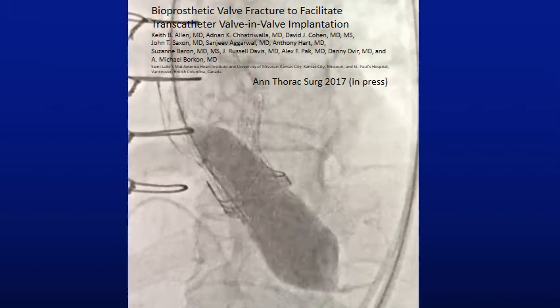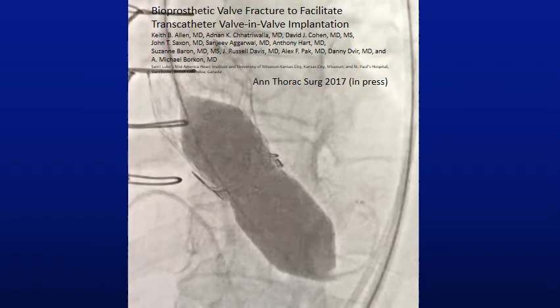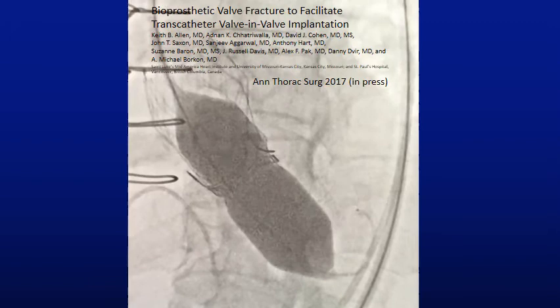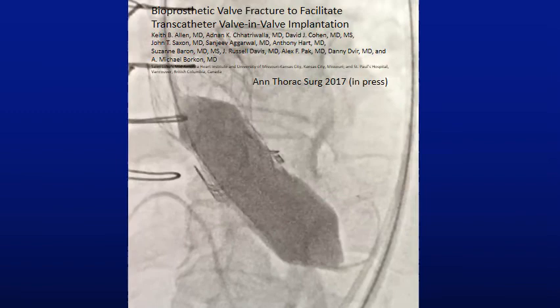If this were a breakable surgical valve, we would fracture the valve using a non-compliant balloon with high-pressure inflation. Observe the waist of the balloon release and the frame pop, with fracture occurring at 18 atmospheres.